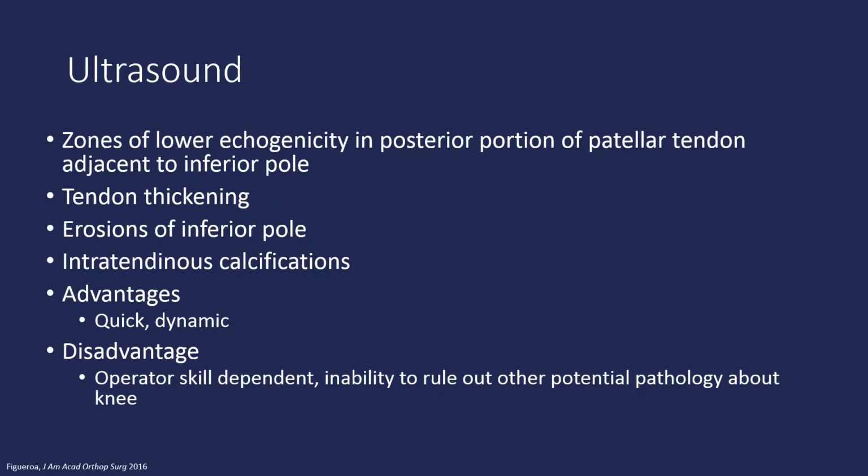Musculoskeletal ultrasound is a great up-and-coming tool for orthopedic and sports medicine clinicians. These images are quick to perform in clinic and can be performed under dynamic conditions. Ultrasound is heavily dependent on the skill of the clinician, and it doesn't allow a full visual exam of the knee to rule out any other potential pathologies, like a patellar fracture.